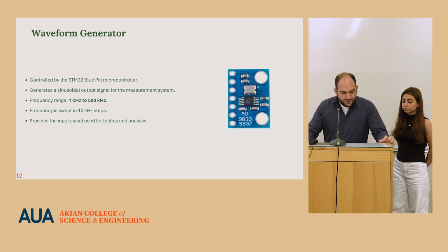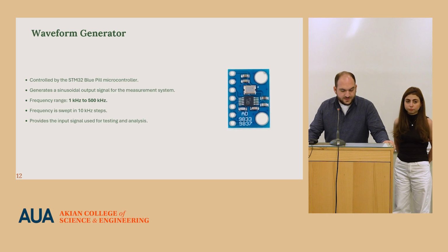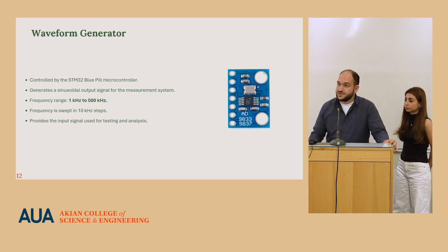As I already mentioned, we use the AD9833 function generator. This is the reference, and this creates the signal from 1 kHz to 500 kHz with a sweep of 10 kHz step.